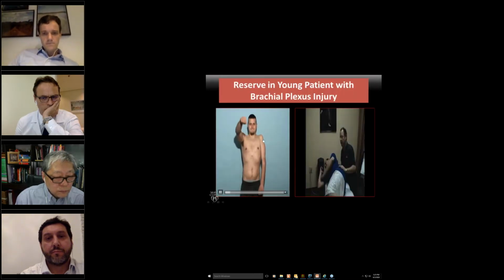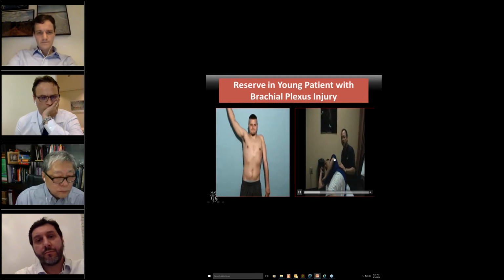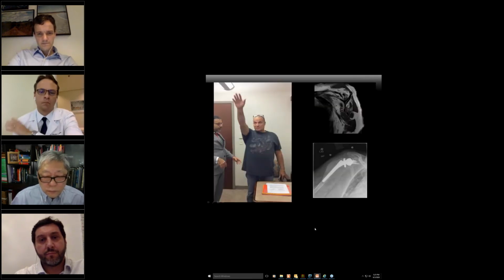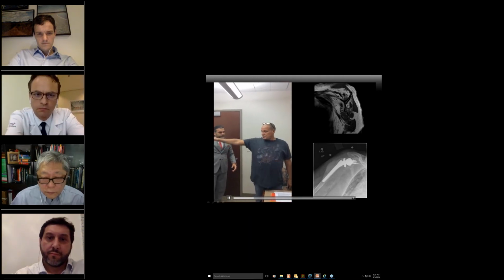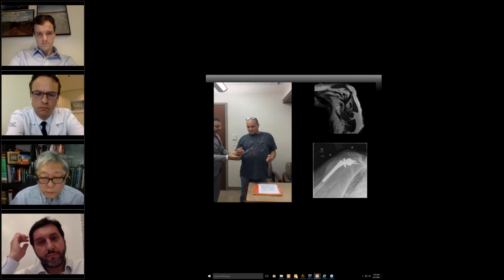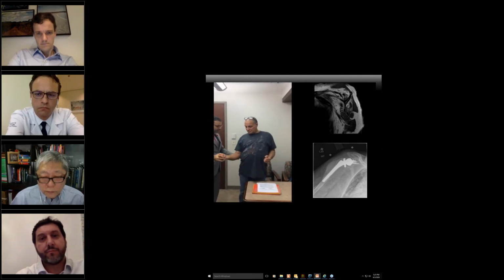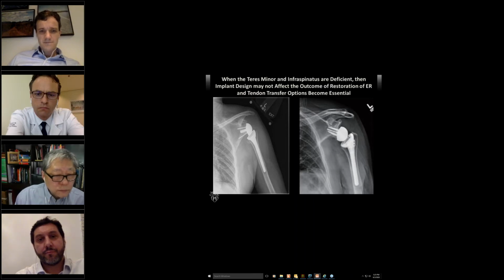Now, I have some patients who had a reverse and a brachial plexus injury, and they thought the lateralized implant would give external rotation, but it did not. And I have a patient who had the surgery, came back and said, you know what, I'm okay, the flexion is okay, but I cannot do my stuff. I have to push my hand to be able to do what I want to do because they cannot do external rotation.